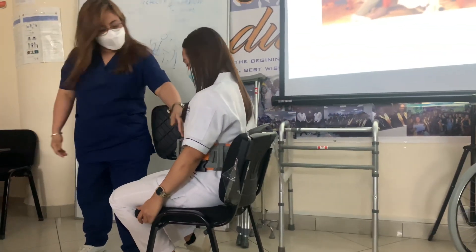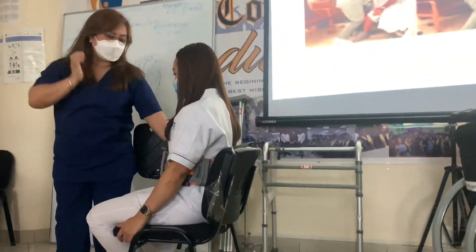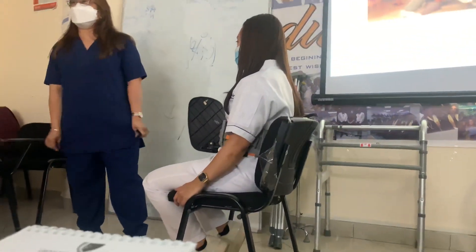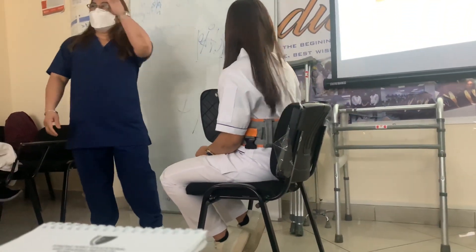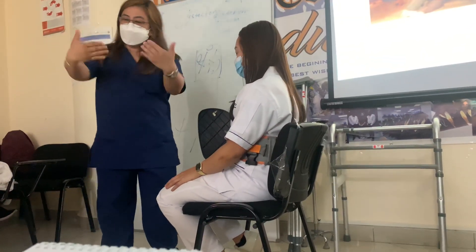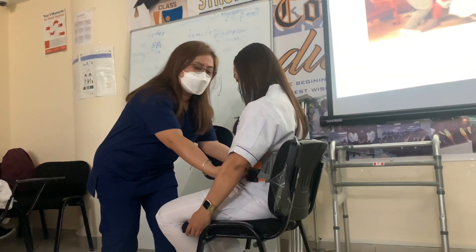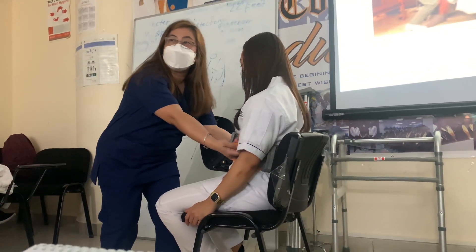So, at least you can place your hands here, but it's still loose. Not too much height, not too much loose. How to properly ensure your hand grip? It must be in up position. If this is the sling, you have to place your hand this way.